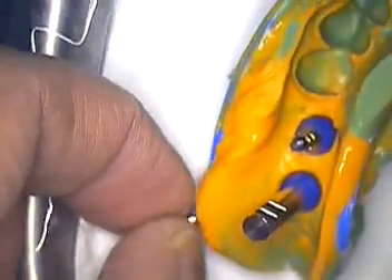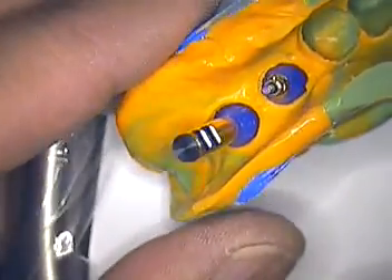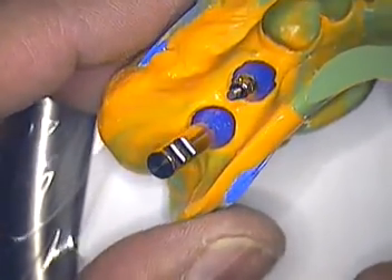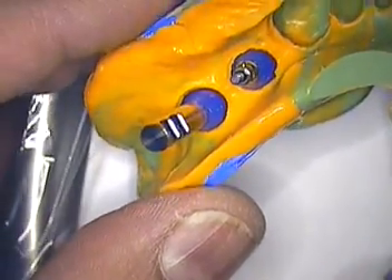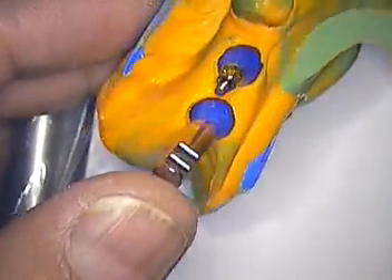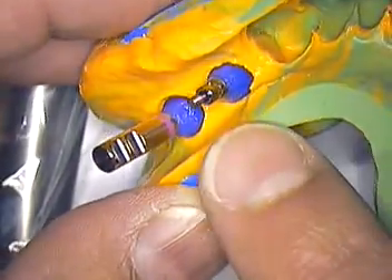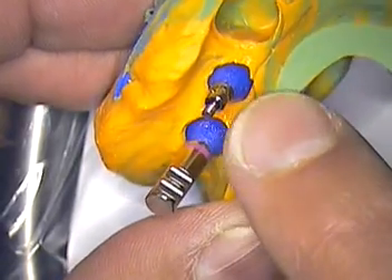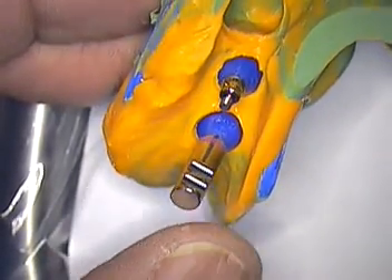Hello everyone and welcome to another video on bone loving. My name is Dr. Jerry Cuomo and I wanted to go over this particular case that I just received from a local periodontist. What you're seeing right now is the impression with the transfer copings that I designed for this case — a simple design, but one that works very effectively.